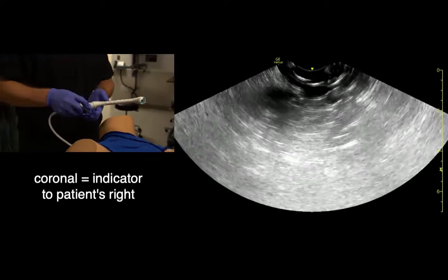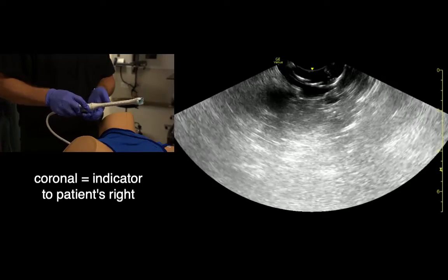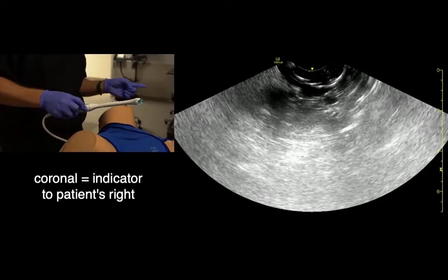For coronal views, we rotate counterclockwise 90 degrees, so the indicator is to the patient's right.